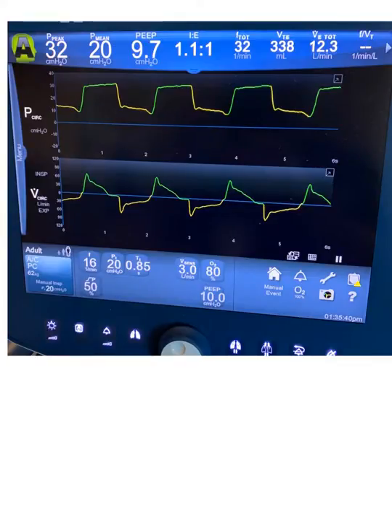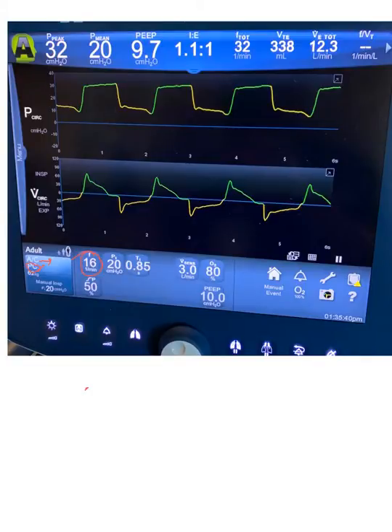Let's demonstrate pressure control mode. As you can see on the ventilator screen, this is pressure control mode. The trigger, by default, is assist control with a backup rate of 16 per minute. The patient trigger is a flow trigger set at a threshold of 3 liters per minute.